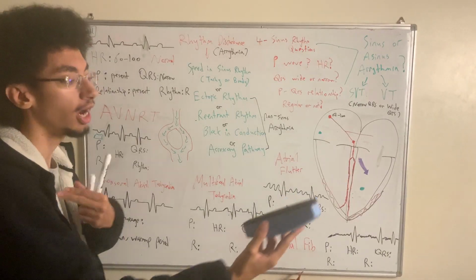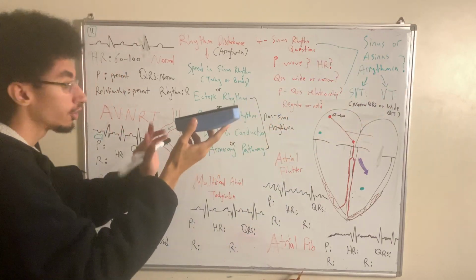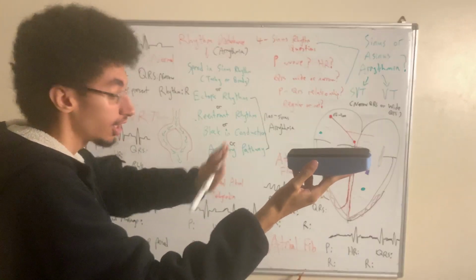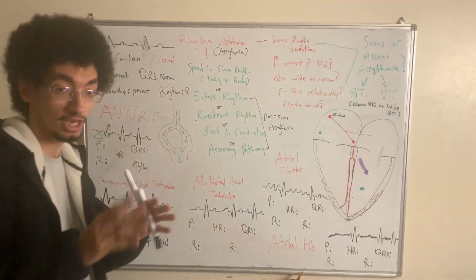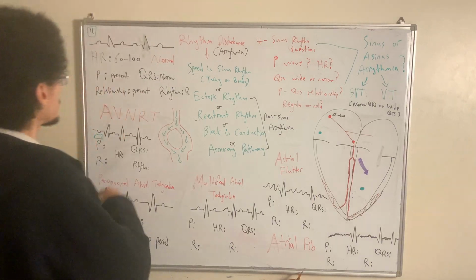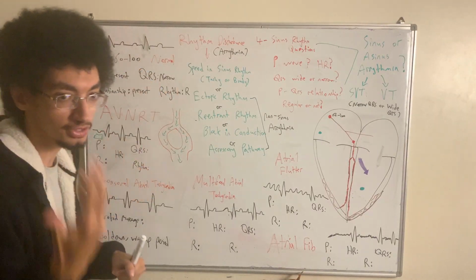I am the chamber. I'm being repolarized. This is a wave of depolarization coming towards me. I tell it, no, I'm not finished. I'm taking a break. Go towards the other side. So that is what's going on right now. So that's why we have a flat segment, and then after that, shortly, we will have another sinus beat.